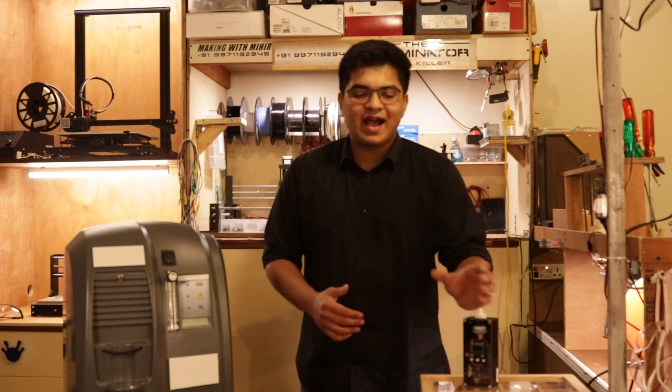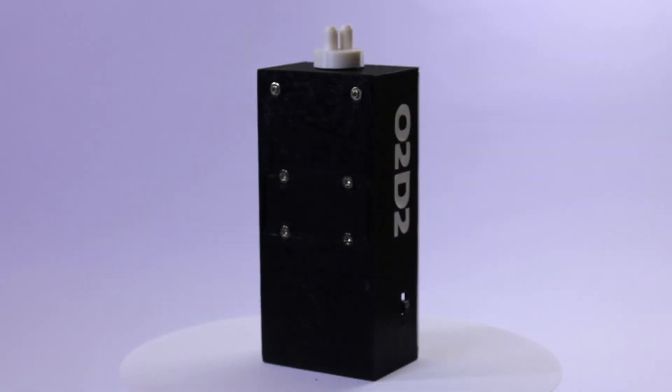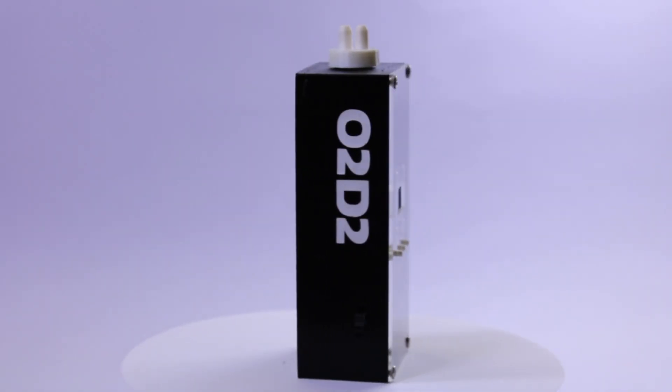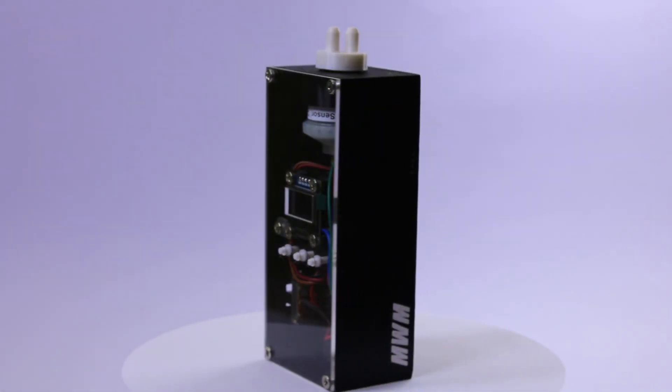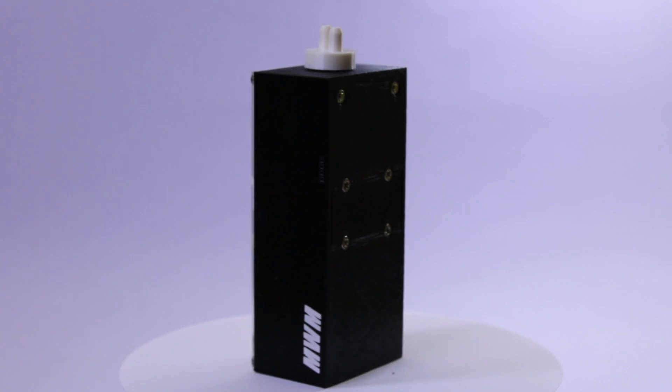After a week of grueling work, I built this. O2D2 is the fully open-source DIY oxygen analyzer. Battery operated, the meter gives you an accurate oxygen reading in one minute and can be built in a day.